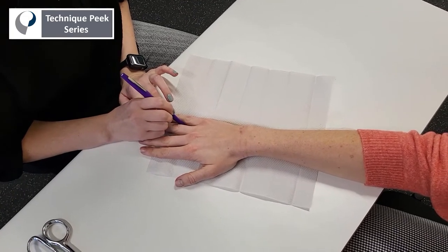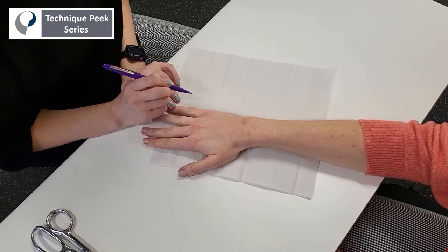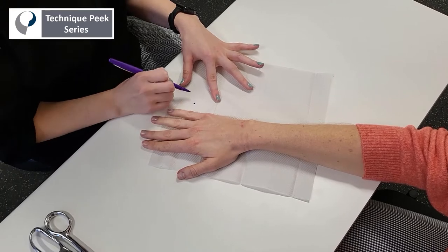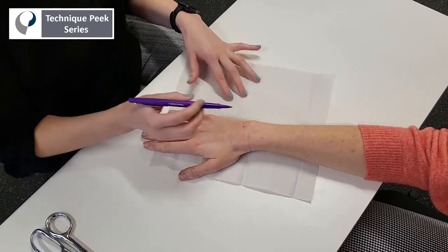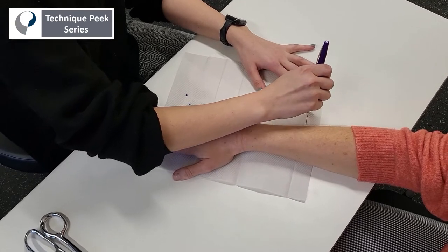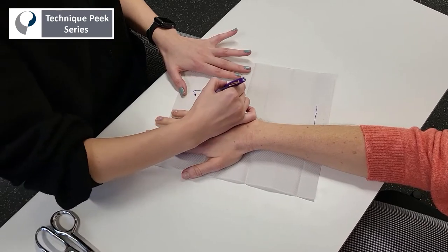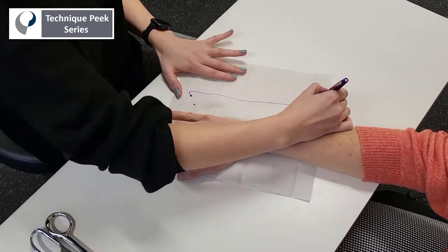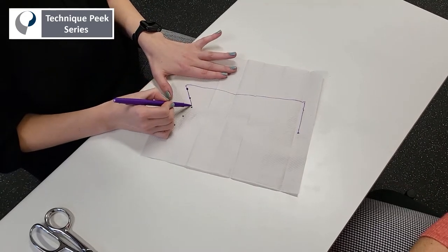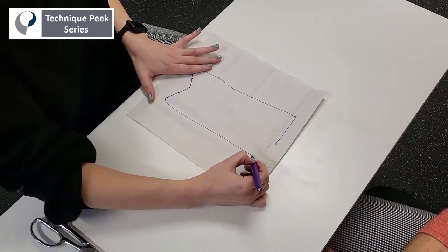Next, you're going to make a mirror image of those two markings, and then trace two-thirds the length of the forearm connecting with that mirror image measurement. Then you can remove the arm and complete your pattern by connecting the dots, making a splint that will encase the fourth and fifth digits and the forearm.